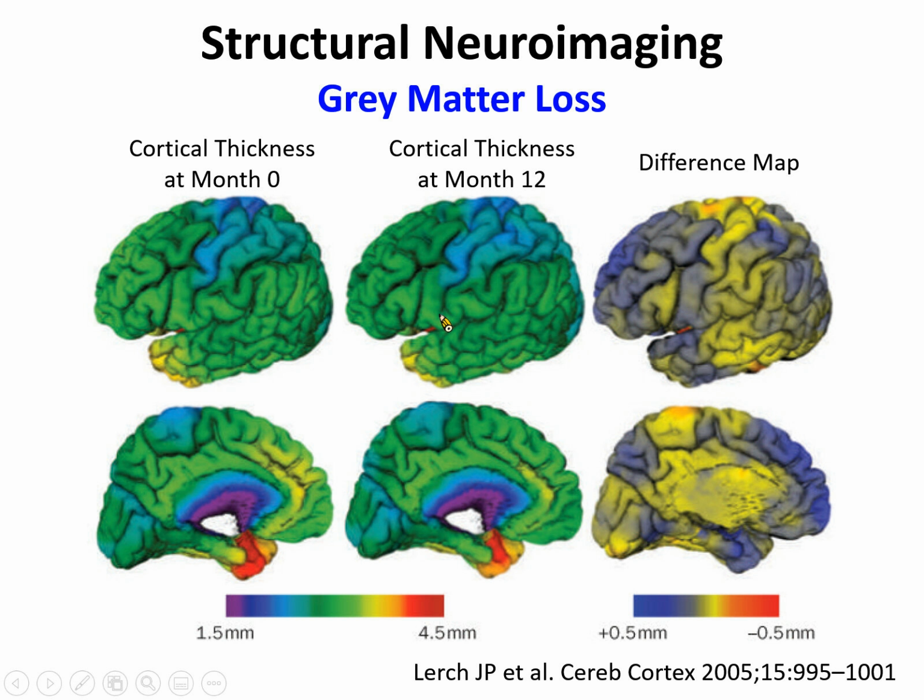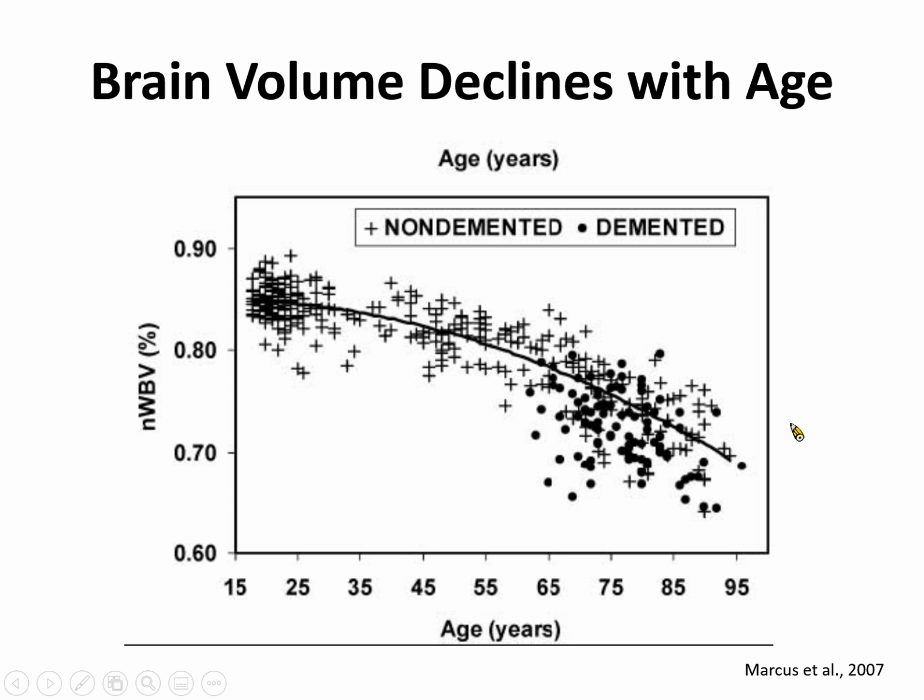The comparison between the patient at the time of diagnosis and 12 months later shows there is brain atrophy in certain brain regions. Again, this is not visible to the human eye, and we can only visualize it with some analysis. We can color this difference so you can see the brain atrophy. That is something we can do based on data science or analytical tools.